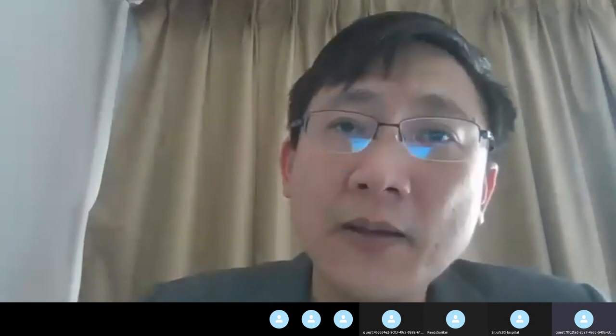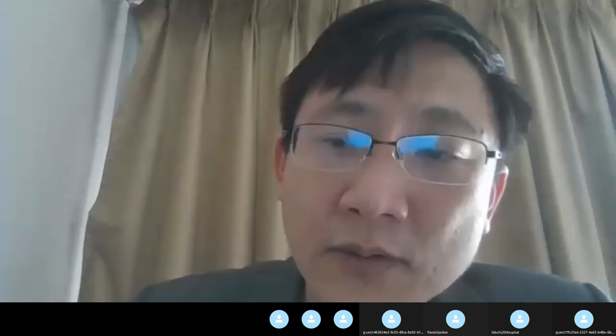So as I say, the ST mode that you set in the machine is basically meant for the time cycle. The time cycle means that if the patient does not breathe spontaneously or is not able to trigger the machine, the time cycle is going to take over. When the time cycle takes over, you can either put it at a low I-time or the normal inspiratory time, or a relatively long I-time, mainly for a recruitment strategy. So those are the two different strategies that you can use.